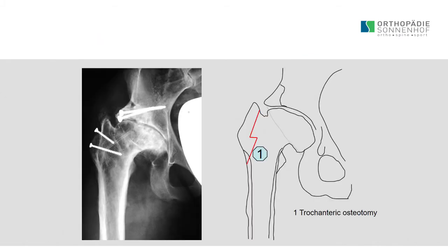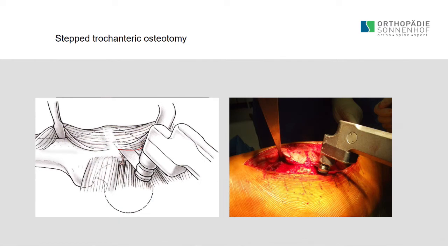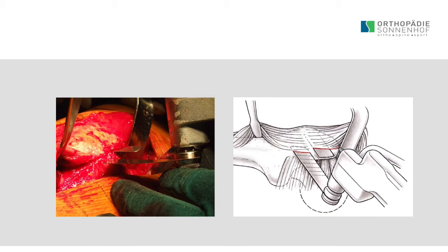So our technique today is for difficult hips, not for the simple ones. In the simple ones, we typically use the anterolateral approach. We still do a trochanteric osteotomy. The trochanteric osteotomy is done with a step, which is different from all those osteotomies described in the early days by Charnley and so on. They had quite a high problem of fixation. We saw this in the nice operation by Klaus Siebenrock yesterday, how we perform the osteotomy. We do a proximal and a distal straight osteotomy, but the proximal one is 3 millimeters higher on the lateral side, and the distal one goes 3 millimeters more to the medial side.